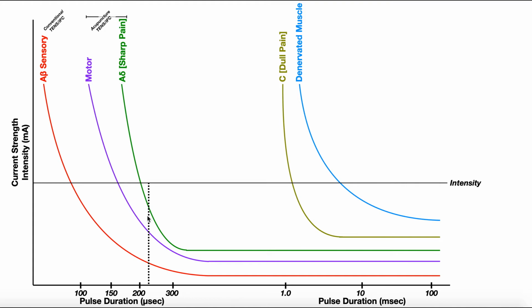Well, for the second patient, they're probably going to perceive a lot more sharp pain because we're definitely getting some stimulation there of those A delta nerve fibers, right? And they might not like that. And so we want to make sure this is as comfortable as possible for the patient. And if they can't tolerate this, well, there's a couple things that we could do. Okay? The first thing which you generally want to try to do is increase the frequency. Now, of course, frequency is nowhere on this graph. This has nothing to do with frequency, but that's just a fact.